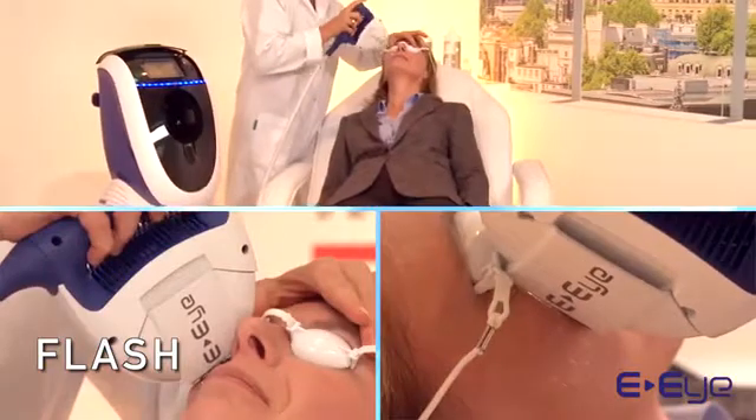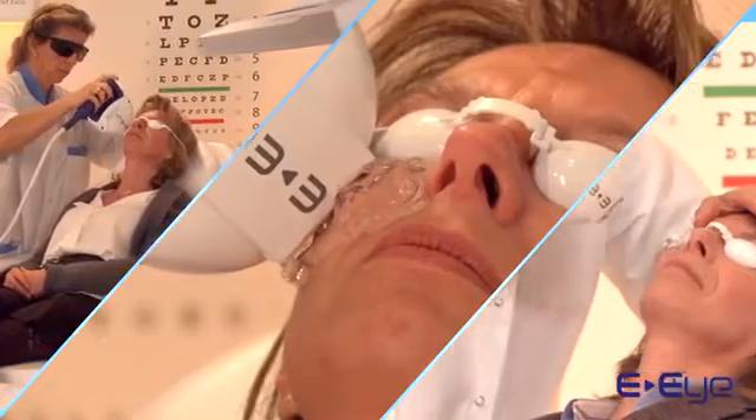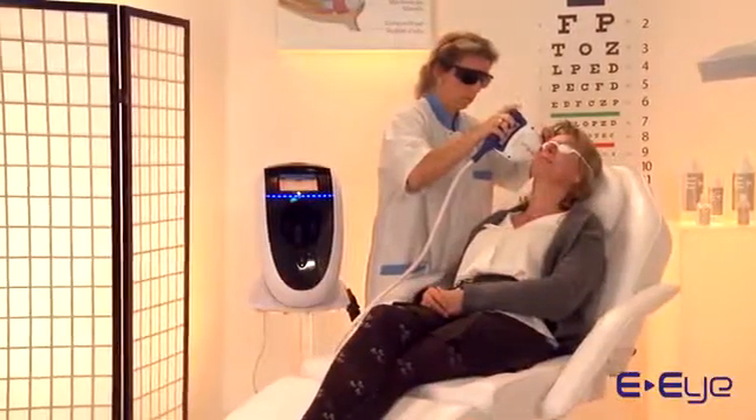Apply five flashes under each eye. Make sure to flash the whole treatment zone from the edge of the nose up to the temple.